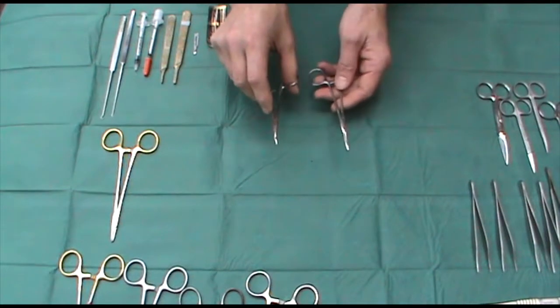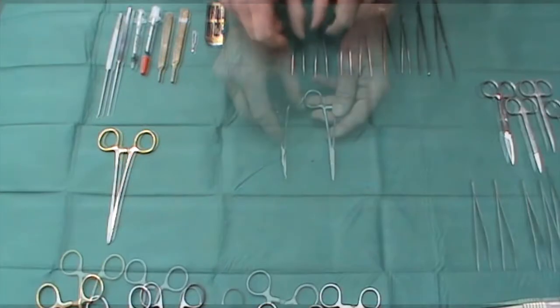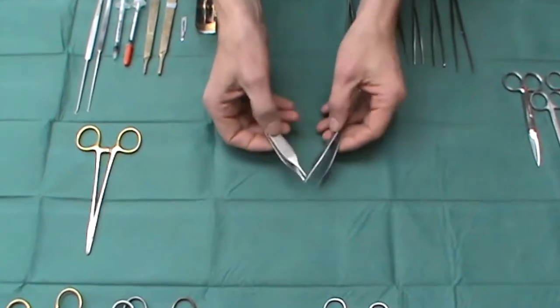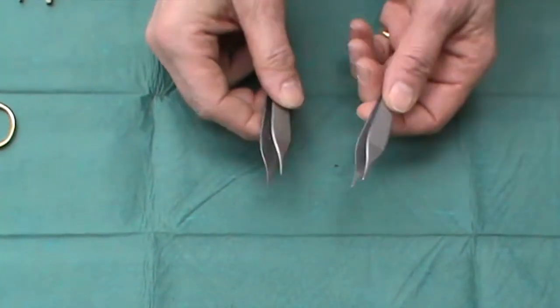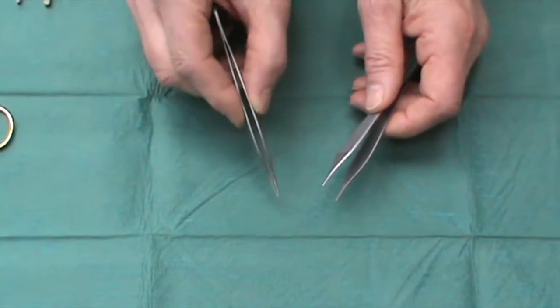Mosquito forceps are also very useful for holding on to bleeding blood vessels whilst you prepare to sort them out. When using tissue forceps, my favourites are these reusable, very delicate Adson forceps — toothed and non-toothed. The teeth are very fine and very delicate on the skin.